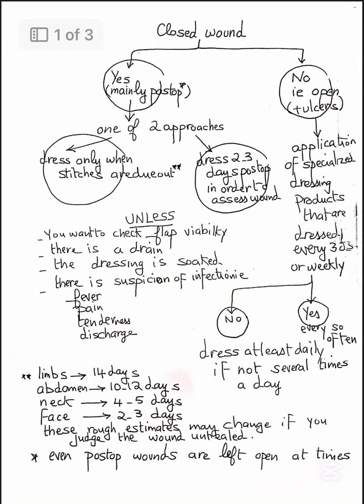These wounds are deceptive. Even without an open cut, internal bleeding, swelling, and tissue damage may be significant. What are drains and why are they used? After surgery or in certain wounds, drains may be inserted into the wound site. So what exactly is a drain?